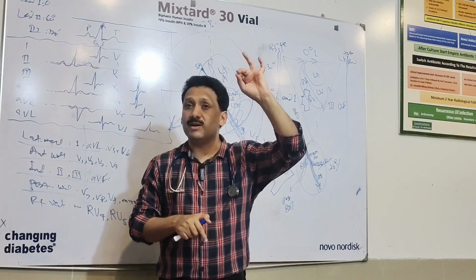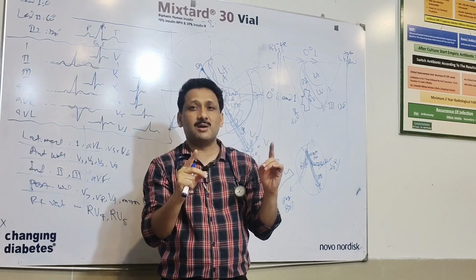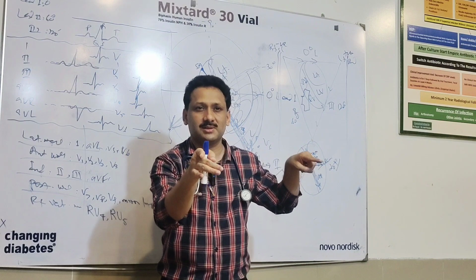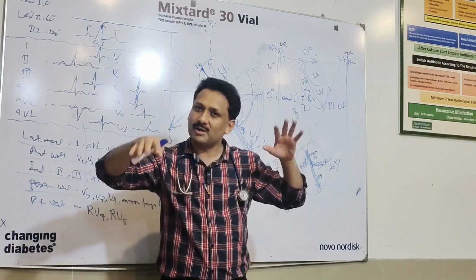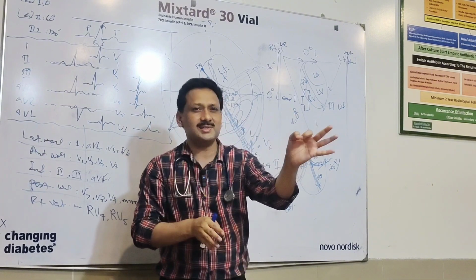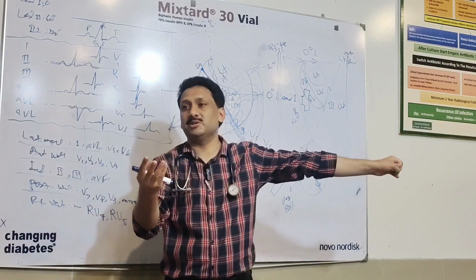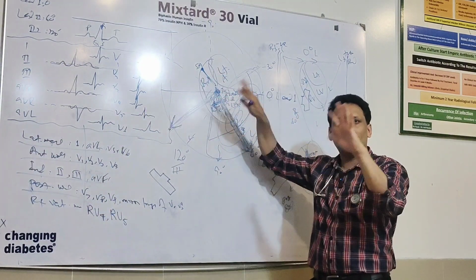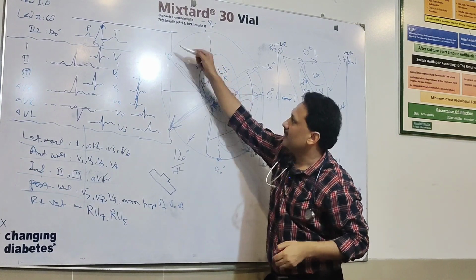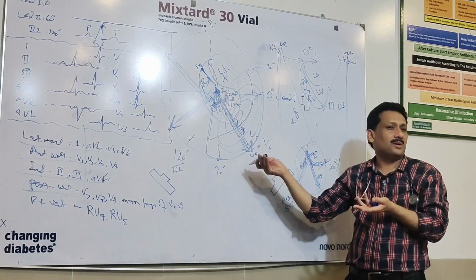So if you ever read ECG, the main thing which you will be focusing on before you interpret the ECG will be that you would be seeing the axis first. All leads will be changed upside down. You need to see, is that person having the normal axis, or his axis has been shifted to right, or axis has been shifted to left. Everything else will change, because all these angle degrees will all be changed if somebody's axis is in this position, say. Now this AVR will be all positive. This too will be all negative.